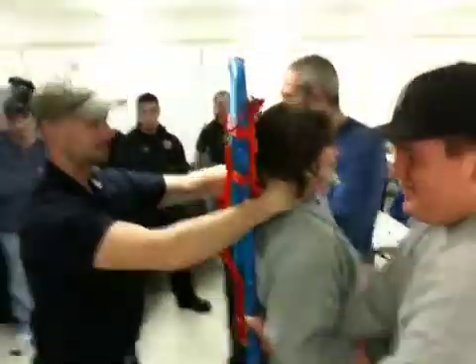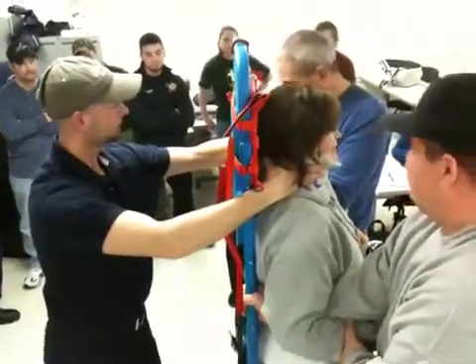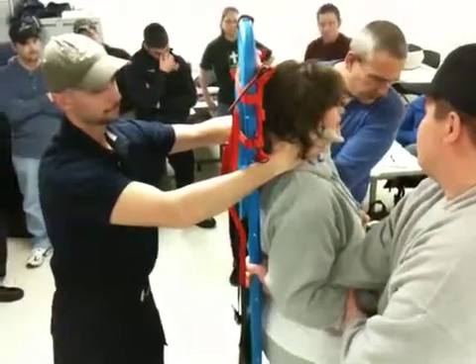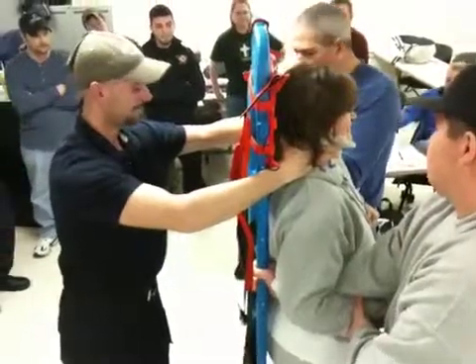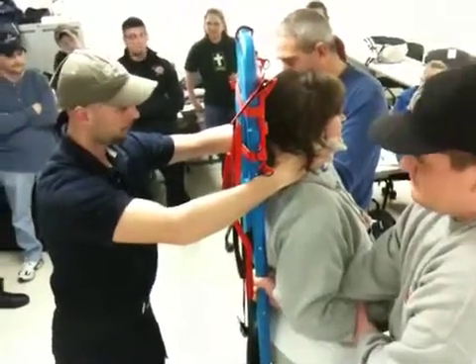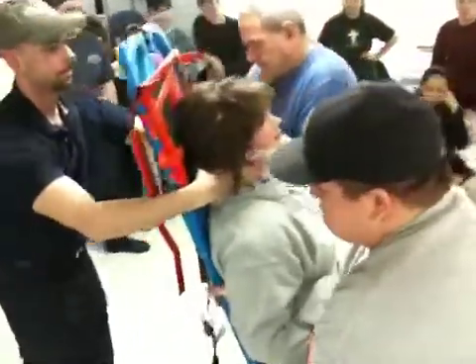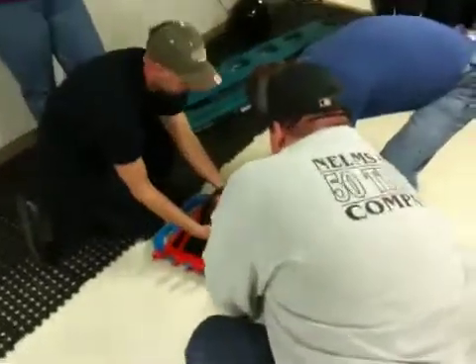We're fixing to lay you down, you're going to have a sensation of falling, but we're not going to drop you, all right? So, on your count, okay, this works real good for short people. No offense to anybody, but because you can't see what's going on and you're already closer to the ground. So, on three, just walk straight backwards and keep your hands in the same position. 1, 2, 3. Okay, now we position her, we strap her in, and we're good to go.